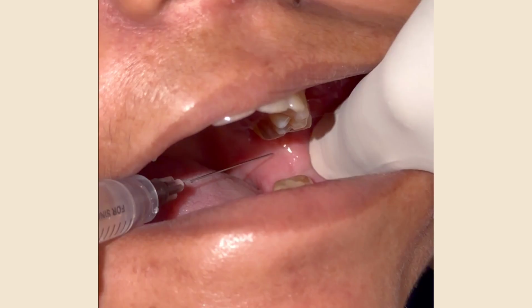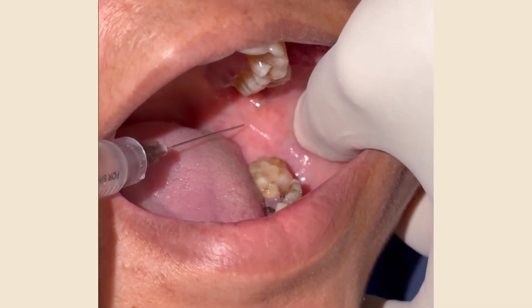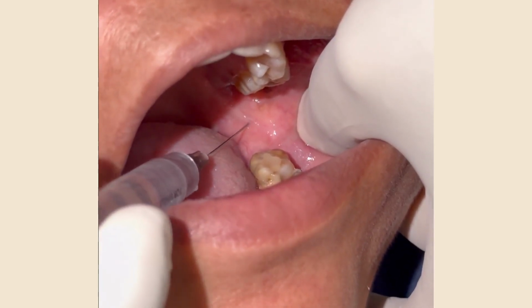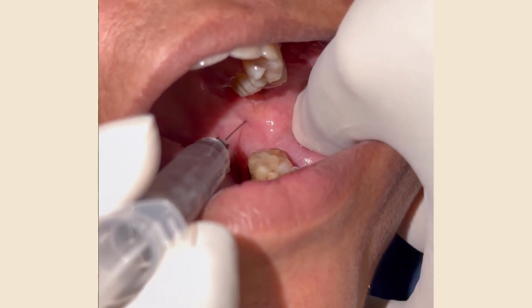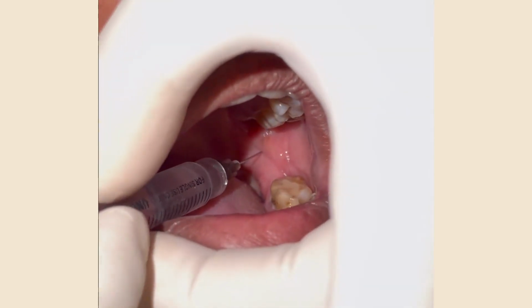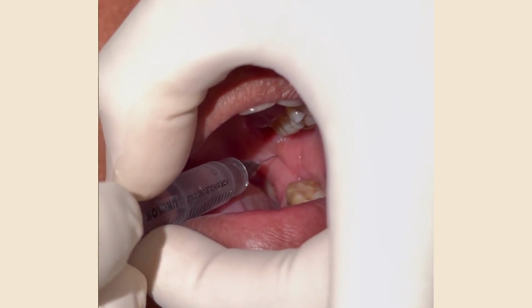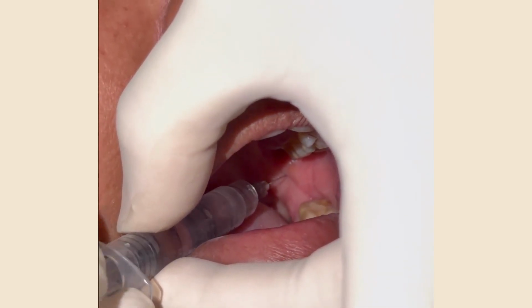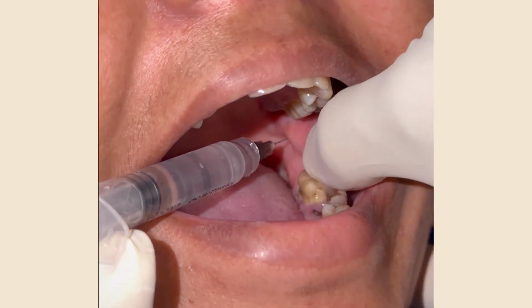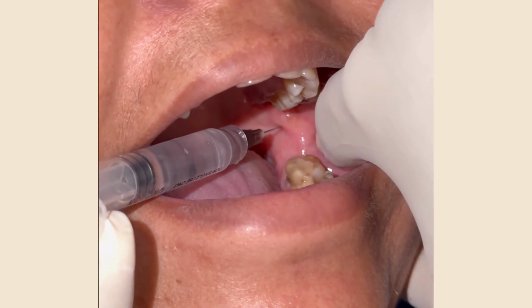So here's a live demonstration for inferior alveolar nerve block. As discussed earlier, the operator has palpated all the landmarks and then after analyzing the height of injection, anteroposterior placement of needle and depth of penetration, he has decided the injection point and then he has aspirated in two planes and after it came negative, he slowly deposited 1.5 ml of local anesthesia over a period of 60 seconds.